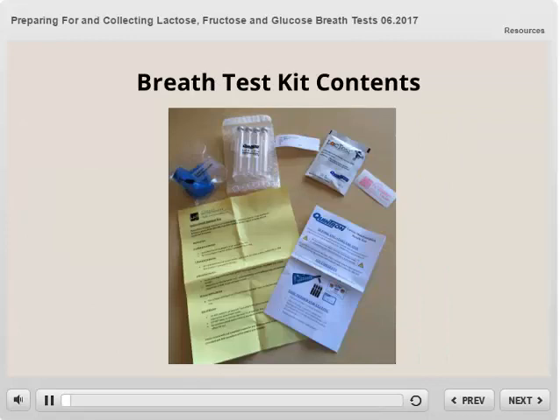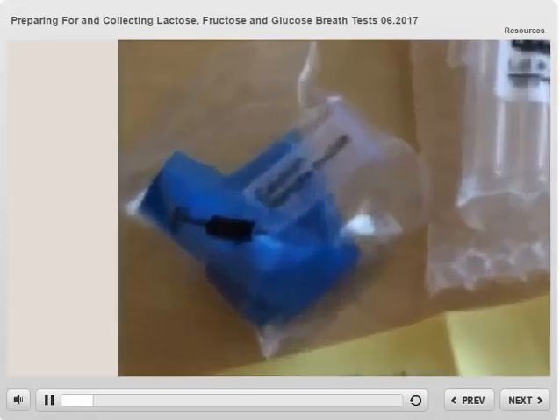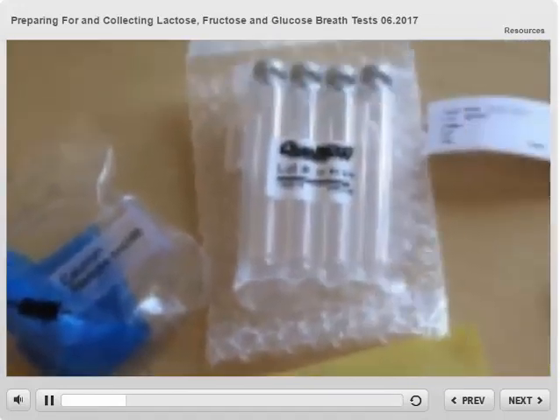First, let's review the contents of your breath test kit. You will have one easy sampler with tube holder. This is what you will blow into when collecting your breath samples. You will have vacuum sealed collection tubes — there are four for the lactose and fructose tests and ten for the glucose tests. Your breath will be captured in these tubes during the collection process. The bubble wrap bag is what you will pack the tubes in after the test is complete.